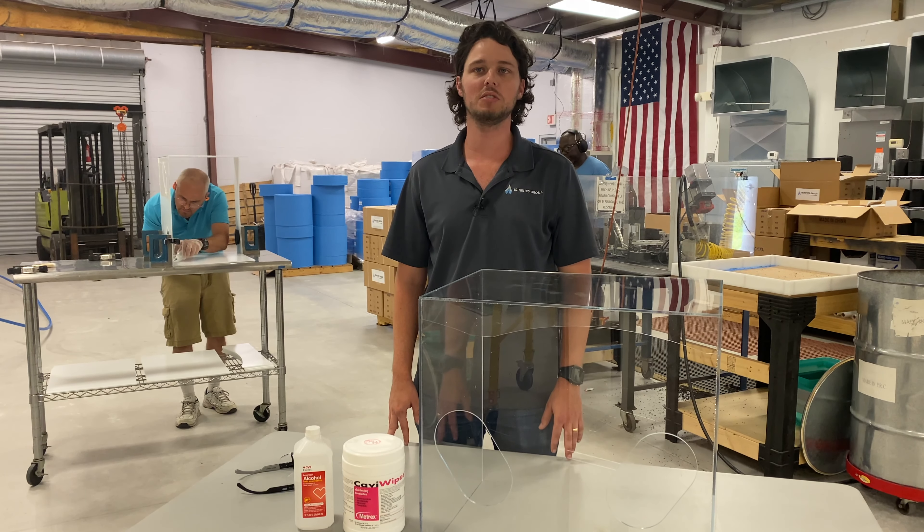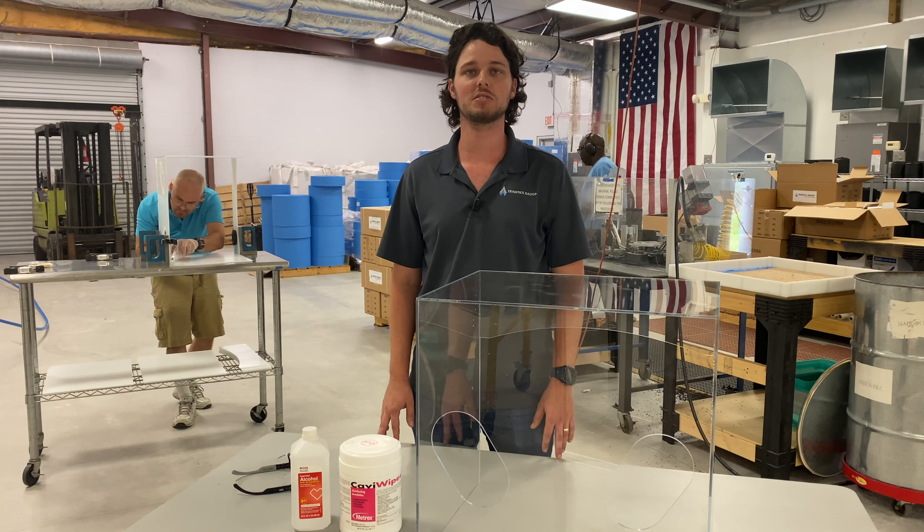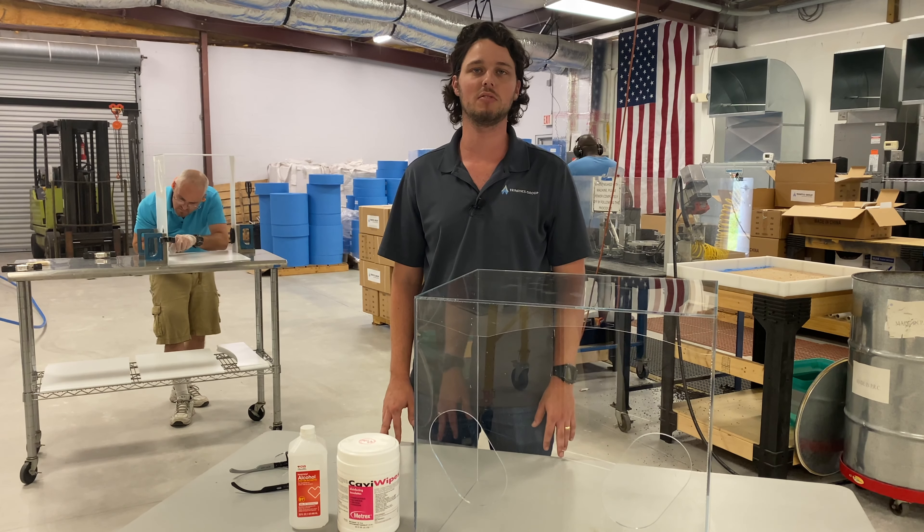As part of our response to the coronavirus, we have reorganized our critical manufacturing lines to allow at least six feet of room between operators.